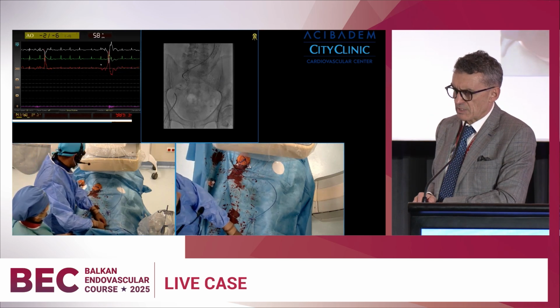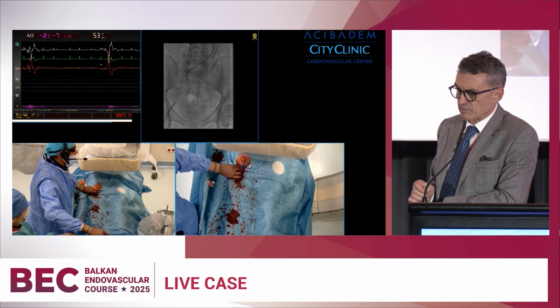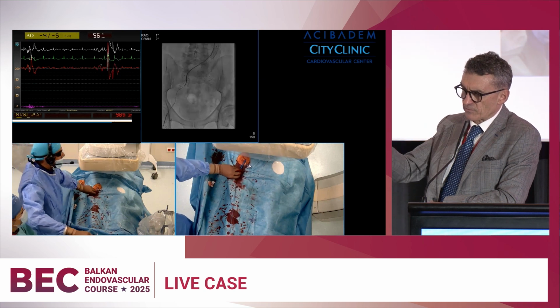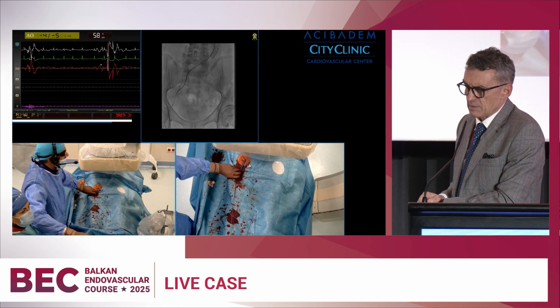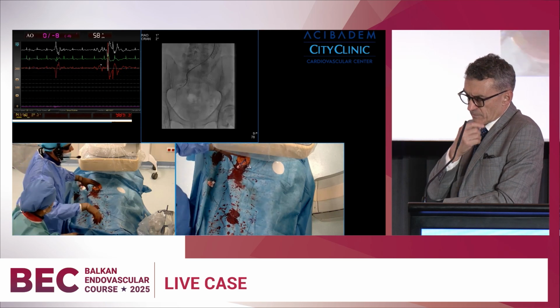I take it. Yeah, you see, do it slowly. It's very well seen that the wire is already inside the lasso. And now this is the moment of externalization. So Dr. Stankov, you see, is pulling.